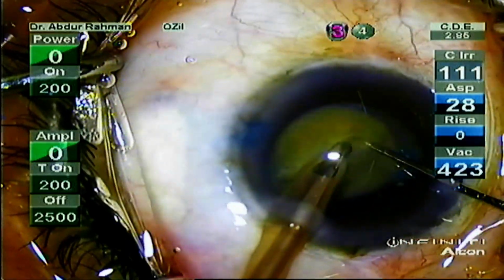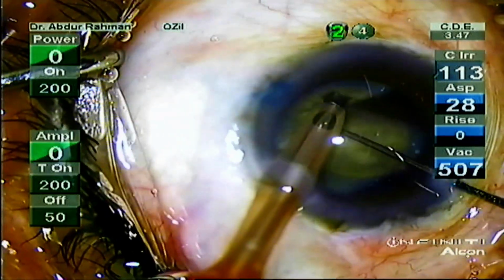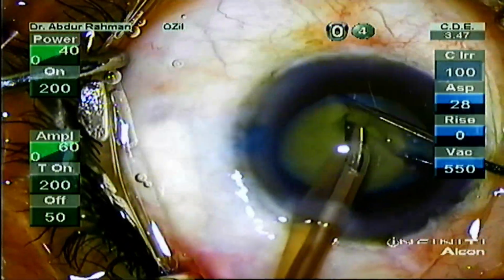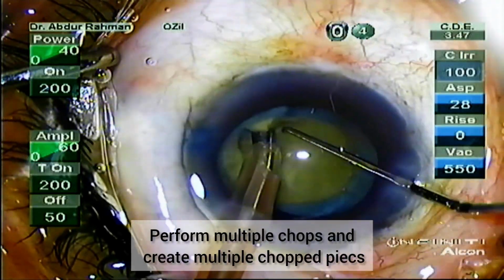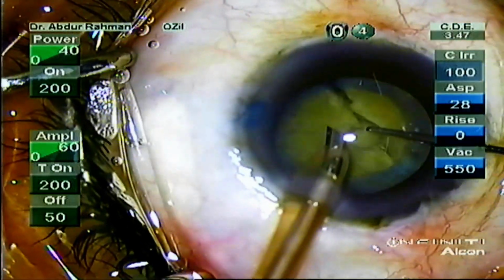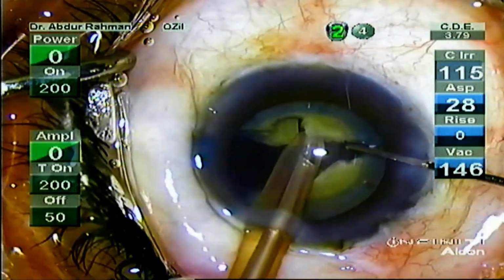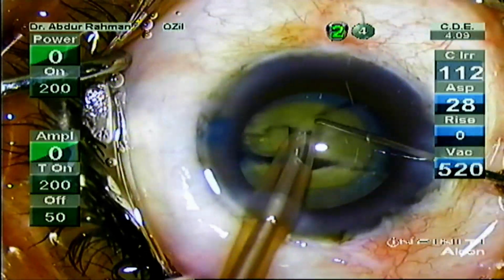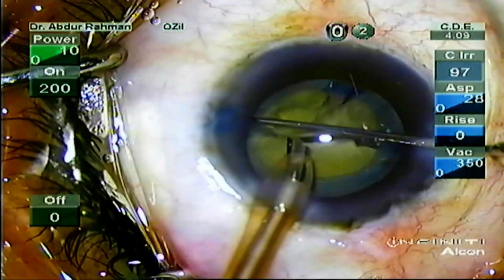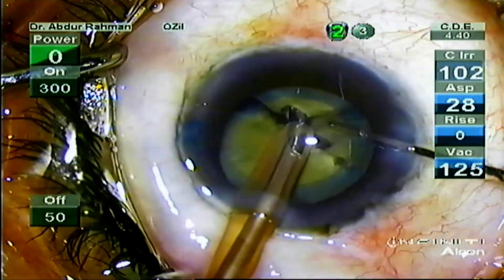Now I'm rotating the nucleus and cracking the nucleus into two hemi-nuclei. But there is a small fiber attaching the two hemi-nuclei. See how the nucleus is spinning from the irrigation fluid. Now again bury and chop a piece. Still there is a piece attached to the other piece.